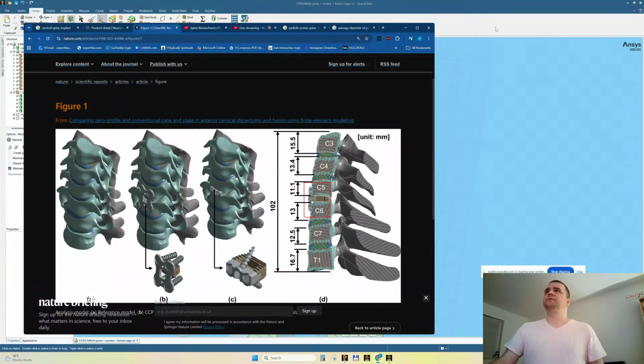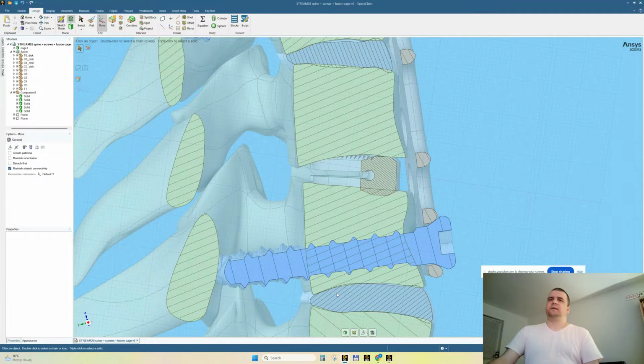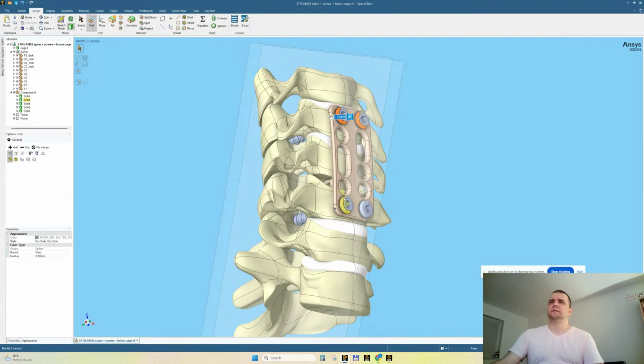So what we are doing is we're shortening the screws. Yeah? So we keep them and we just shorten them. How many? 1, 2, 3, 4, 5. Let's keep only 5. I don't know how to say threads. No, because there is only one thread. 5 peaks. Then cut. Hide others.